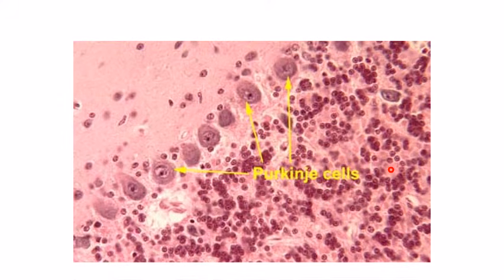As we said before, the levels of the CNS are shown in slides, while the cerebrum and cerebellum are shown in light microscopic low power, and the Purkinje cells in high power under the microscope. Now we are going to do the trial exam.